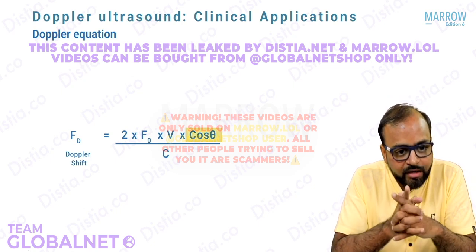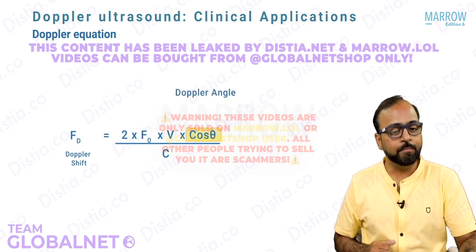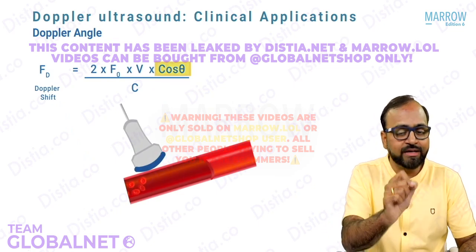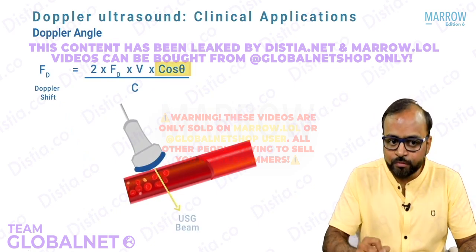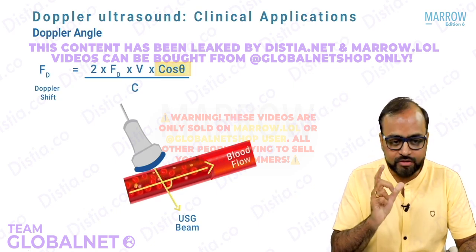Now this theta that is used as cos theta in this equation is what is called the Doppler angle. What is the Doppler angle? Look at the situation here. The Doppler angle is nothing but the angle between the ultrasound beam which is emitted from the probe and the plane of blood flow. This is called the Doppler angle.